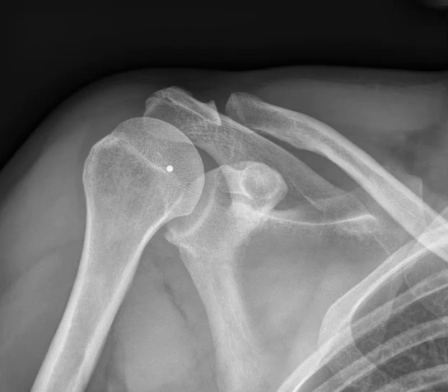This is an x-ray of the patient's shoulder. This round thing here is the humeral head, and over the top we will see the rotator cuff. The supraspinatus component of the rotator cuff goes over the top, and there's another component in the front that comes horizontally and attaches over here called the subscapularis. We try to go through a little window that's below the supraspinatus up top and above the subscapularis — about here is the target position.